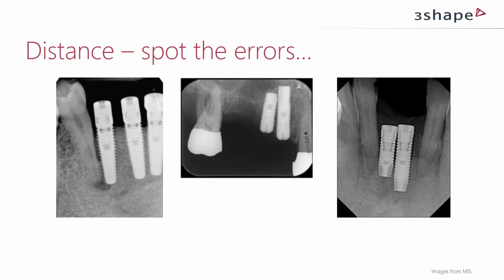We have a good map: we have nature itself with the teeth, how they are positioned and everything. So if we look at them and try to emulate the same variables with positioning, with length, with the directions and forces, then we are more likely to succeed than otherwise.